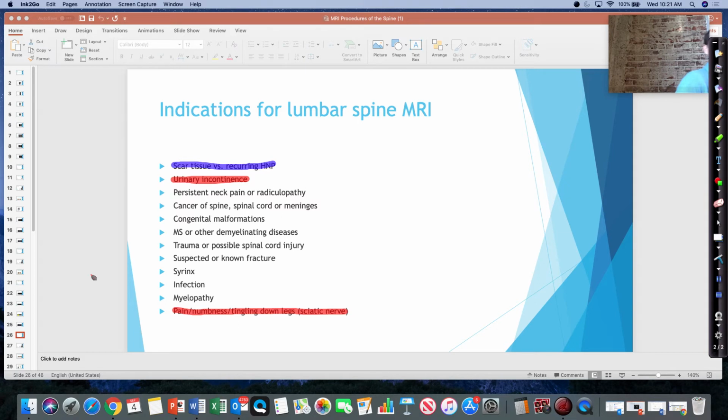Things like that. That's a very common one, where as you get older, you get that back pain, and it's usually coming from that sciatic nerve, which originates from the sacrum. So that sciatic nerve is originating from the sacrum. So when you're scanning those patients, make sure you cover a little bit further down than you think. Sciatic nerve runs from the sacrum down their legs.